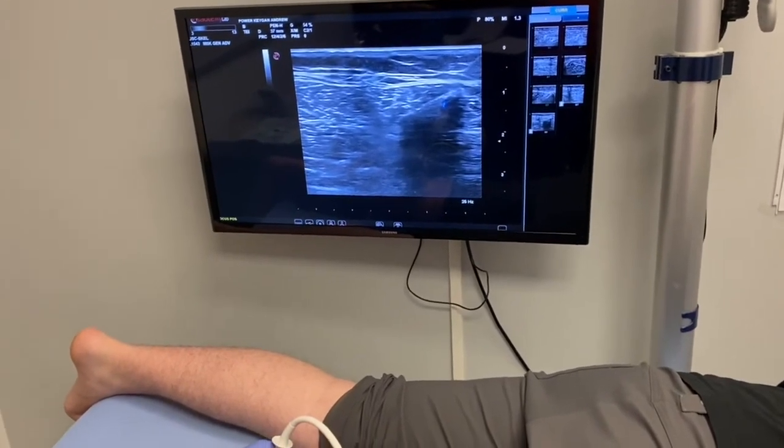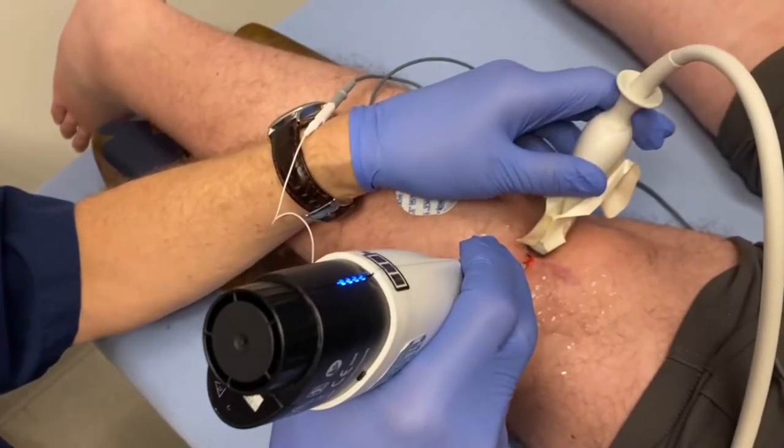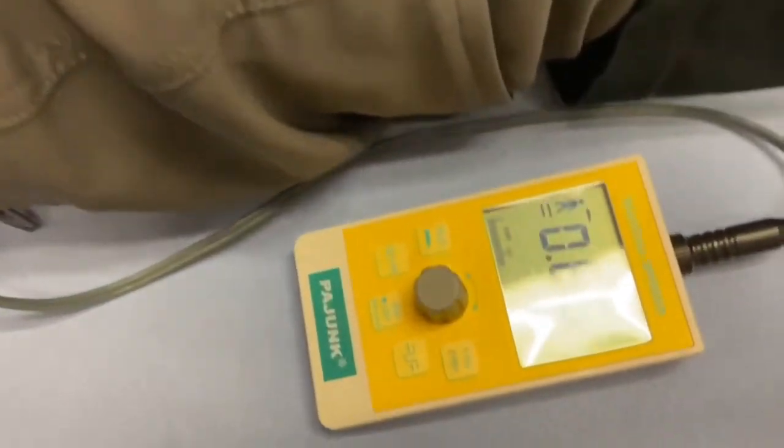This is a real live demonstration of Dr. Vincent holding the probe in. Dr. Vincent decided to try one case as he retired this week, just to make sure he approved of the equipment so we can move to the future.